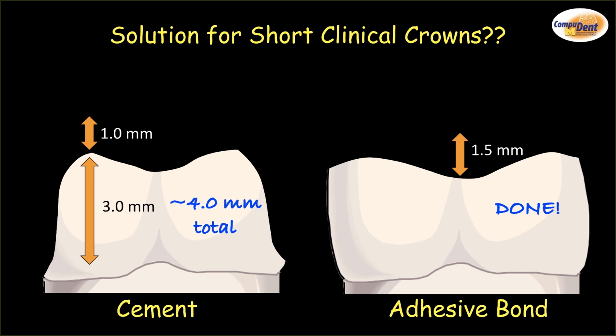Now, you have to have a lot of confidence in your adhesive bonding technique and material to do this. Because you're thinking, well, gosh, if I just set that on top, isn't that going to slide around? Isn't it going to rotate around? No, because you're not trying to cut a flat surface. You want to have topography in it so that when you go to try that in, it centers itself and it doesn't spin.